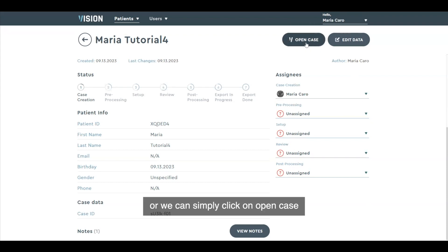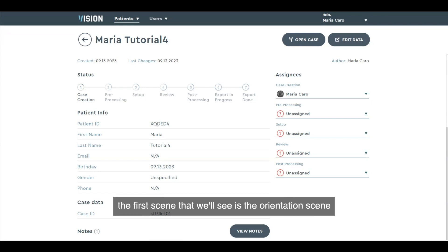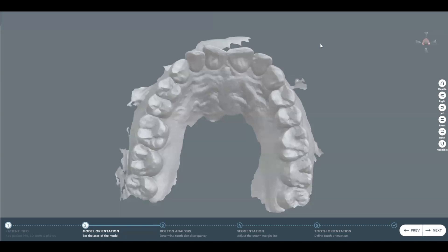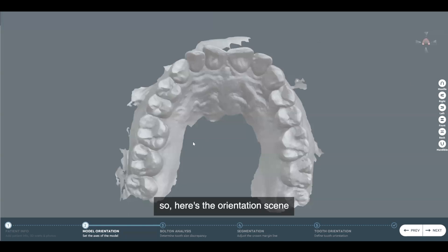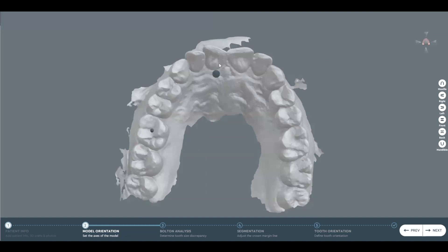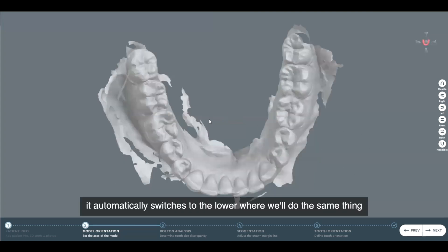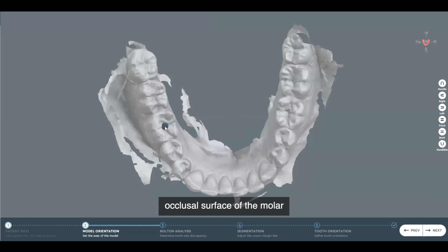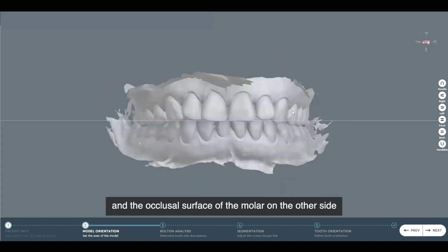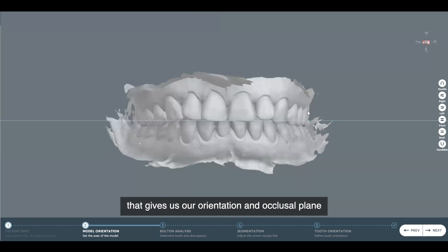Or we can simply just click on open case. When we click on open case, the first scene that we'll see is the orientation scene, where we'll be placing three landmarks on our upper and three landmarks on our lower. We'll place one on the occlusal surface of a molar, the next one on the incisal edge of a central, and the third again on the occlusal surface of a molar. It automatically switches to the lower, where we'll do the same thing: occlusal surface of a molar, incisal edge of a central, and occlusal surface of the molar on the other side. That gives us our orientation and occlusal plane.